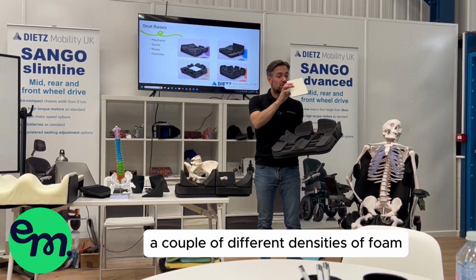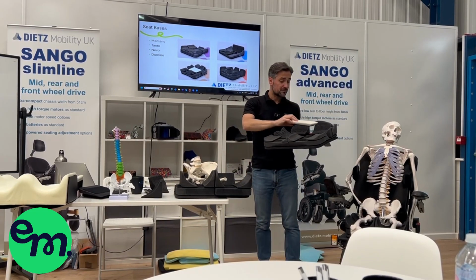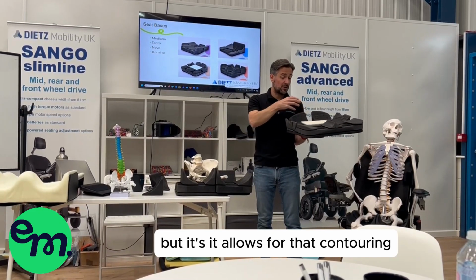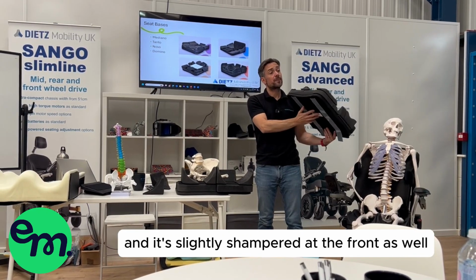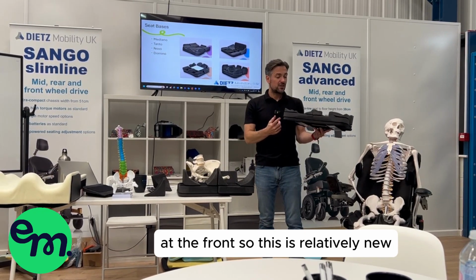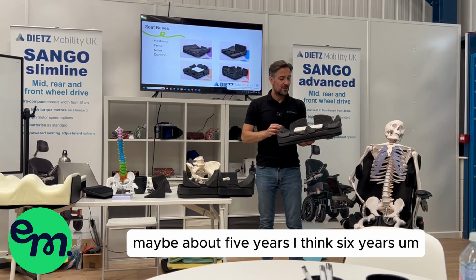So they've got a couple of different densities of foam, and then you've got the other foam that goes on top of it. This is all a little bit softer. So again, from a transfer perspective, it's easy to get in, but it allows for that contouring, and it's slightly chamfered at the front as well. So when you put it into an active chair, you've already got that little bit of a cutout at the front. So this is relatively new, maybe about 5 years, I think, 6 years.